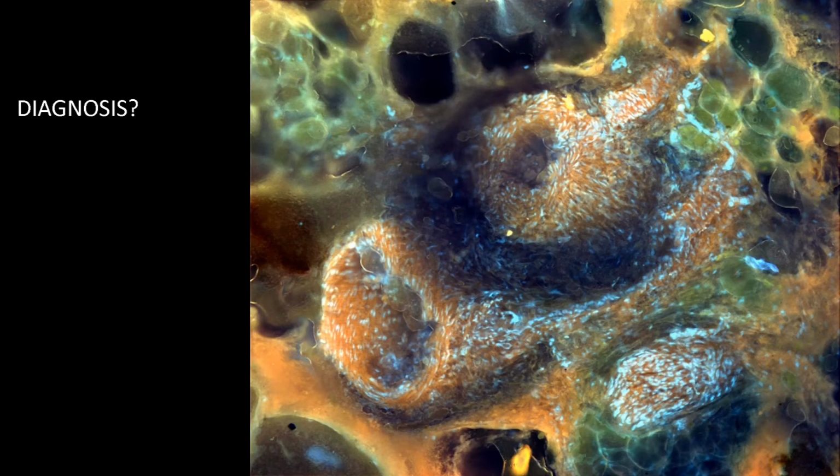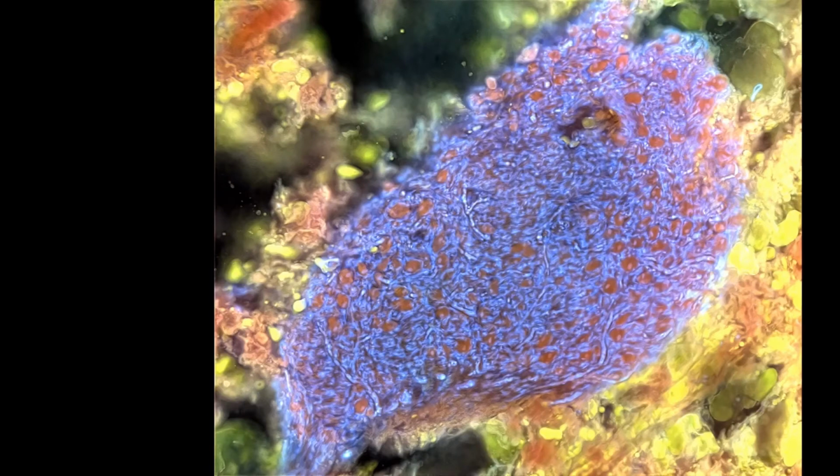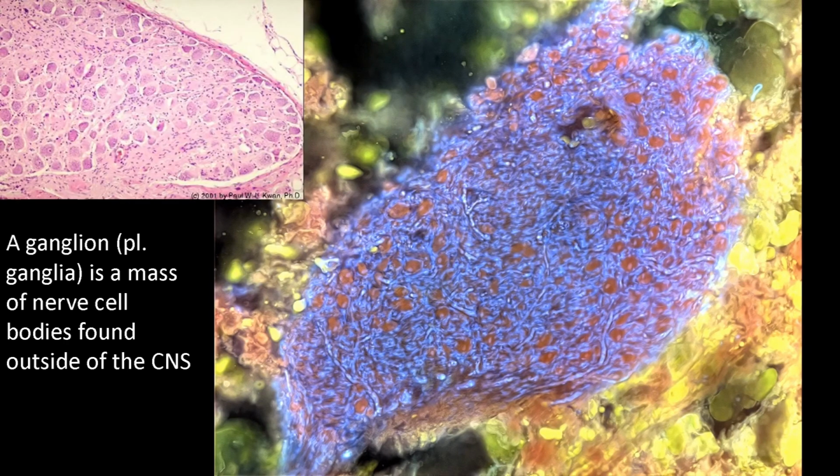So here's another challenge for you. Well, this is a large vessel. Here's another vessel. This is a nerve. This is fat. The diagnosis is Italian sausage. This was taken by one of the high school students, and it helped precipitate my flight into vegetarianism. Here's another question. Anyone want to hazard a guess as to what this is? It's a ganglion, and found in a different sausage.